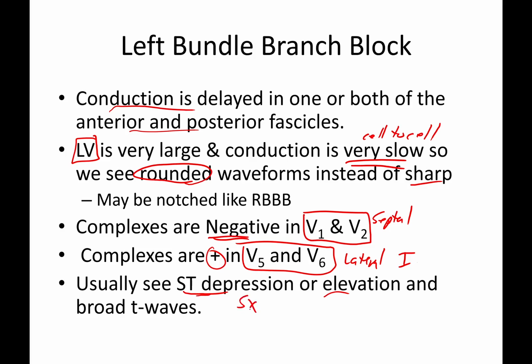But what you need to do again is add up the symptoms. What are they doing? How's the patient look? How are they behaving? You know, if they're having chest pain, that's important. If they're not, well, we still need to keep a close eye on them. And that's why we do serial EKGs to track to see if those ST elevation or depression, to see if those ST changes are worsening, improving, or just maintaining the way they look, and it's a baseline that you're essentially hunting for at that point. And of course, any new bundle branch block is going to be considered pathological.